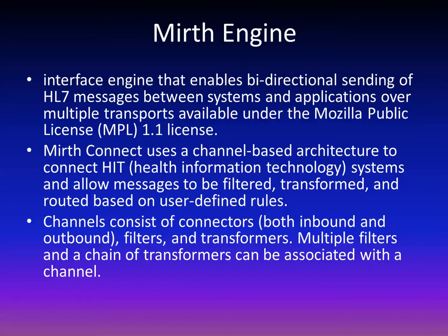We are basically using our Mirth engine kind of like the edge gateway that Radius uses, to allow them to not have to have a VPN at each different facility. We're doing that with our customers, so we have to make a safe connection between the Mirth engine and the individual EMRs, but now we don't have to make a new connection to Radius every time. We just need one connection. That's the idea behind using the Mirth engine, and it makes things a lot easier for us.